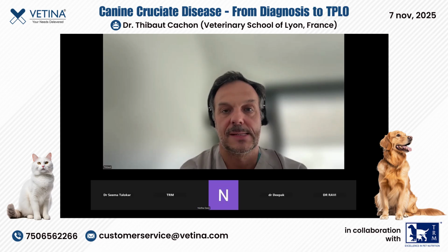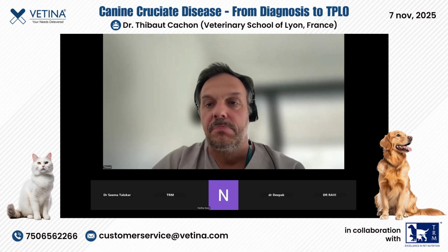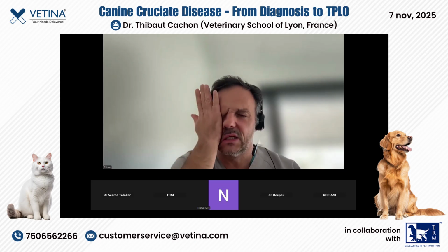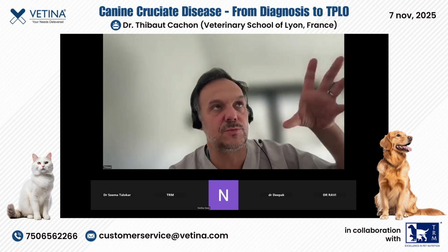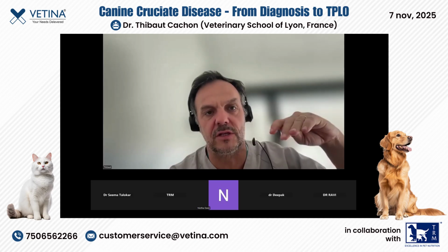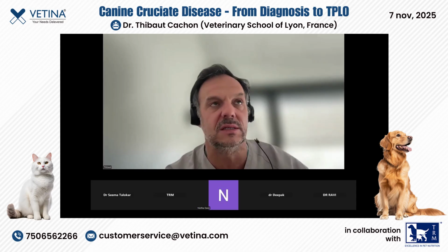One last question we will take. What is the normal angle, and from which angle is it best to consider TPLO? Normal angle and the best angle. The mean angle of the tibial plateau slope in large breed dogs is 25 to 26 degrees. In small dogs, it is a little bit higher, 29 to 30 degrees, more or less.